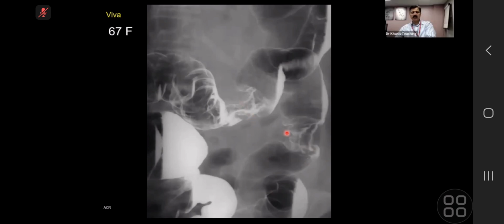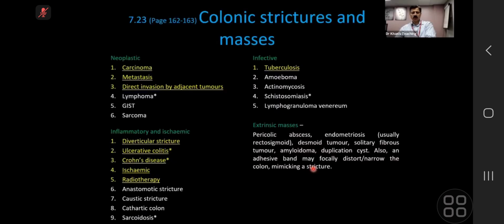Spot diagnosis, candidate 4, just give me the diagnosis. What's happening? These two strictures, benign or malignant? There is some shouldering and some mucosal irregularity, so I'm going to go malignant. Excellent. So these are synchronous tumors, two tumors sitting there.